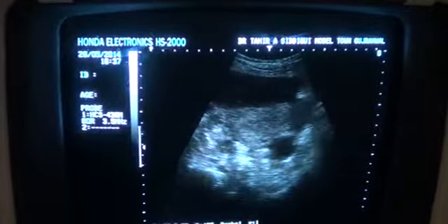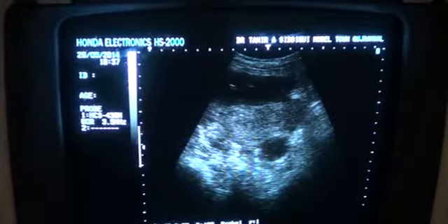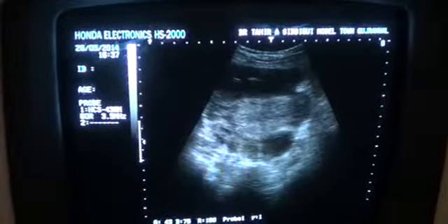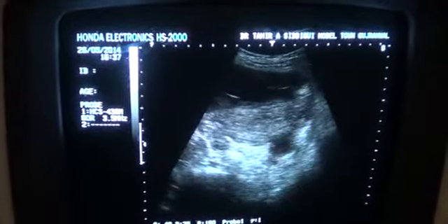Okay. Now this patient has been referred for protuberant abdomen, as tight as we see in peritonitis.